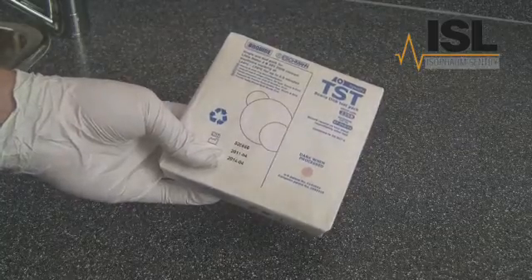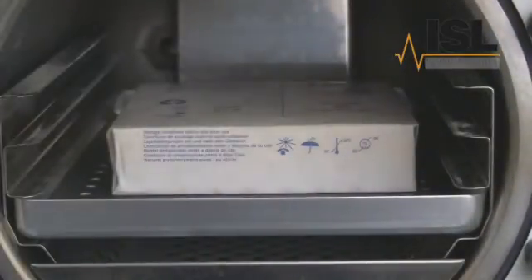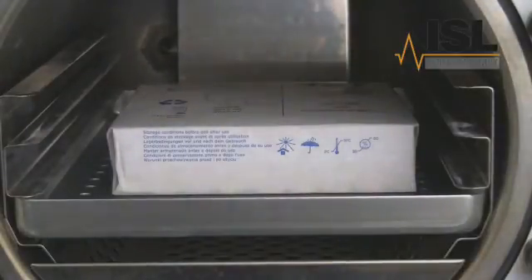Take a Bowie Dick Pack. The test should be performed with only the furniture and the Bowie Dick Pack present — no instruments should be processed in the chamber at the same time. If you also perform a daily automatic control test, you may want to save time by performing both these tests together.